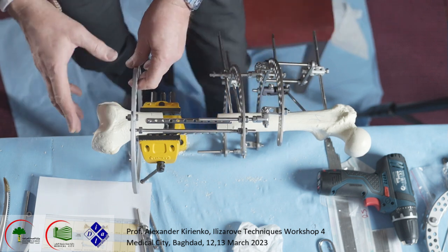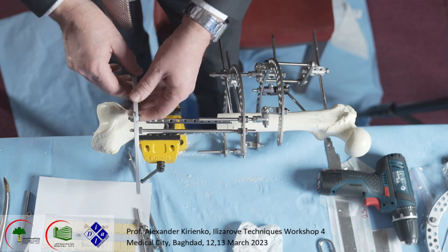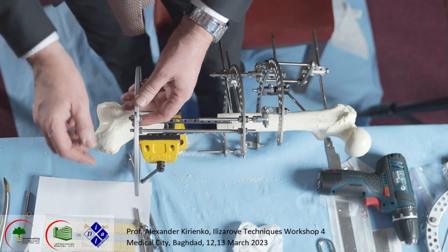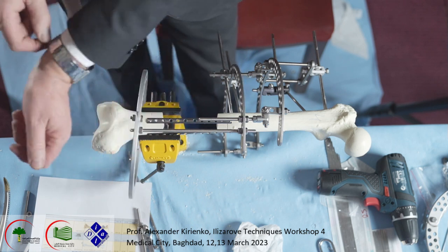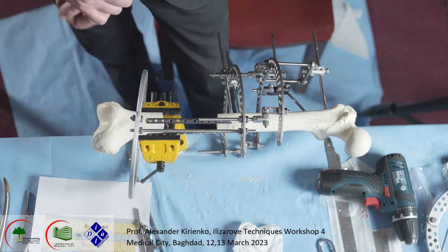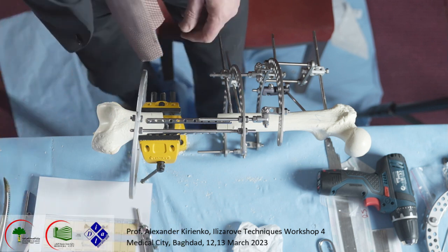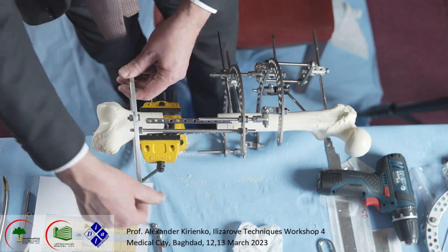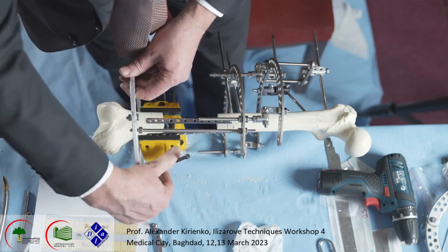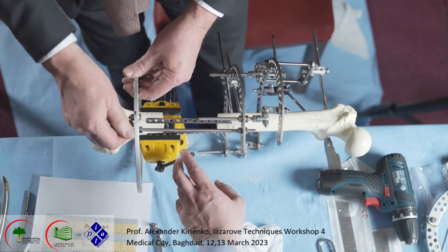We orient it again on the line of the condyle, like explained before. If you are sure that you achieve a good realignment, you may put a straight rod like I do now, because I don't have deformity.